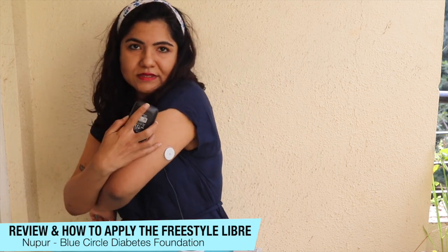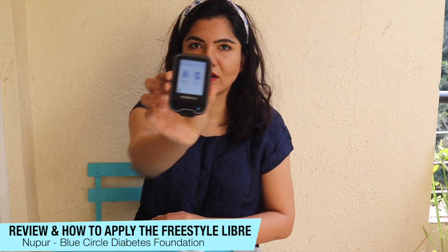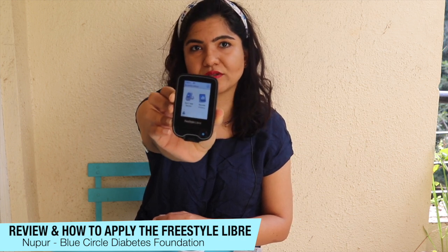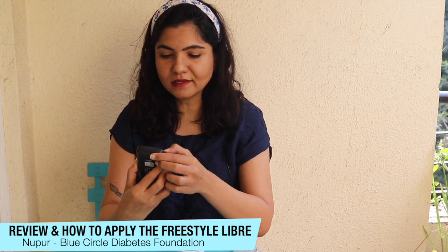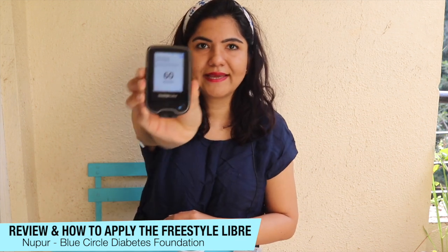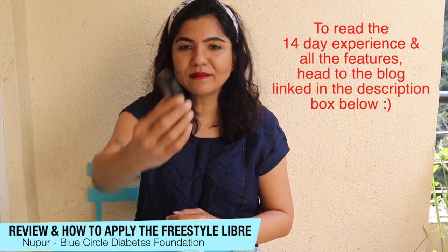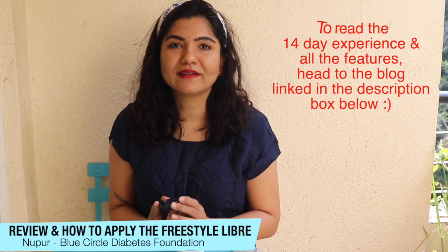I need to make sure that I activate my sensor. Here's the new sensor I just applied — I need to activate it. So I'm going to power on the reader. You will see two options on the screen: start sensor and review history. I press start new sensor and then hold the reader to the sensor. It says it's going to take 60 minutes to start collecting readings. So that means if I applied it now, after 60 minutes I'll be able to see my readings on this reader.